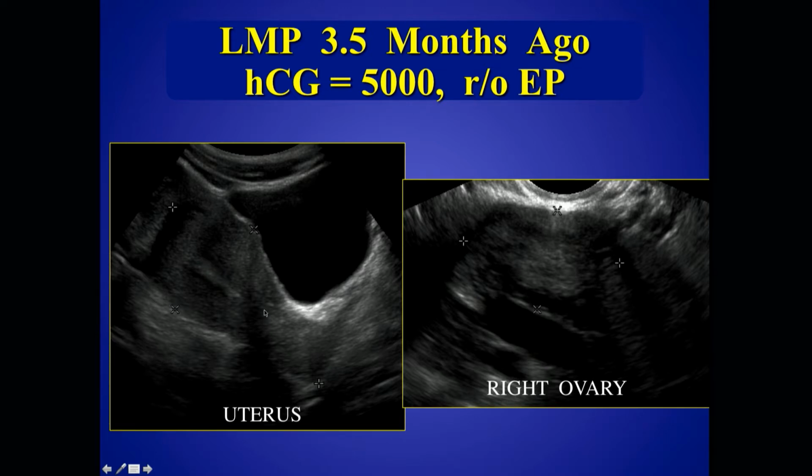And you may be asking, why do I do all this transabdominal imaging? The answer is, I'm looking for masses that are outside the field of view in an endovaginal scan. Many times I find things on the transabdominal scan I do not see on the vaginal scan alone. So I typically will augment that, particularly when I'm ruling out ectopic or in patients with large pelvic masses like fibroid disease. It can be very helpful.